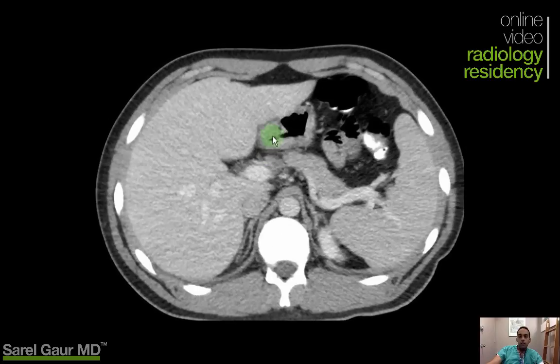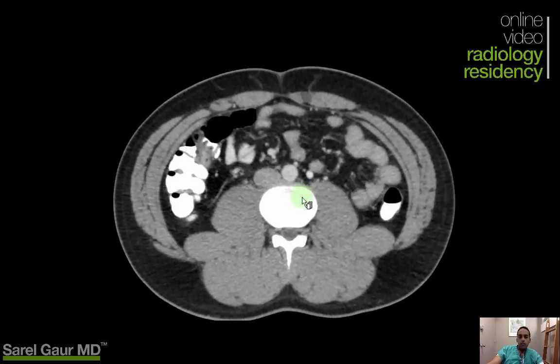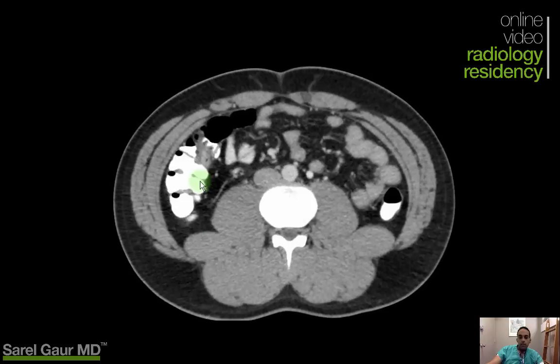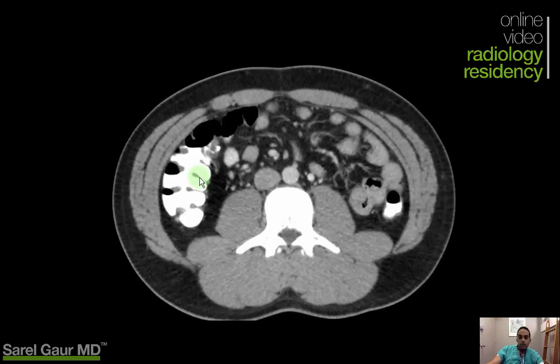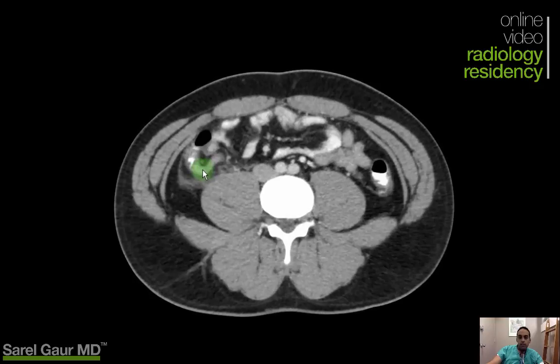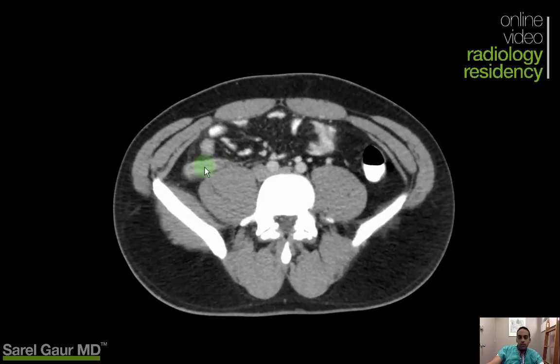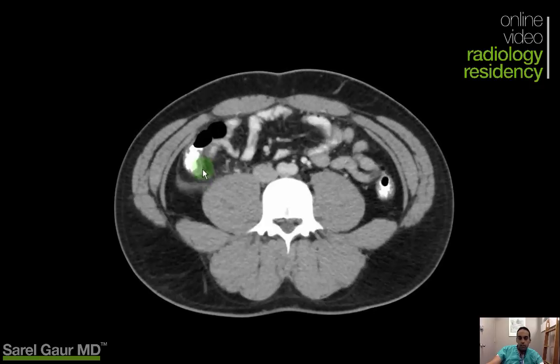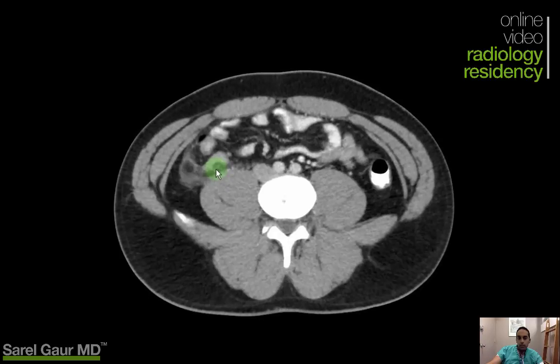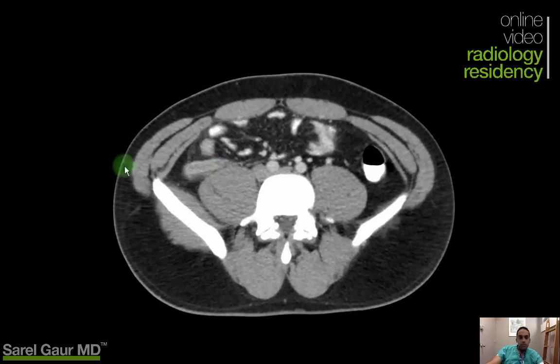Next case: 17-year-old male, right lower quadrant pain, concerned for appendicitis. Scrolling down, looking on the right side, I can see the right colon. This looks like a positive case. Here's the colon, and I can see the fibro-fatty lips of the ileocecal valve. Coming lower, I see a tubular structure in cross section with hyper-enhancement along the periphery, fluid filling within it, and fat stranding around it. I can see it curling up, extending off the cecum. It's not filling with contrast even though there is contrast in the cecum — this is definitive appendicitis.